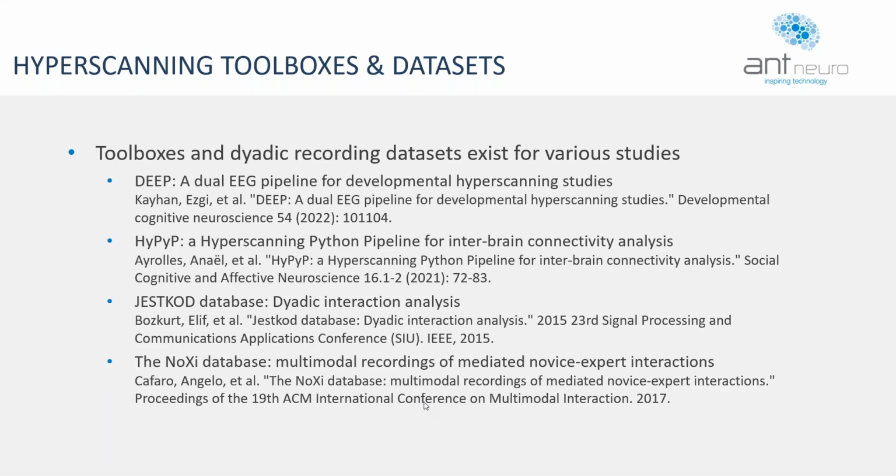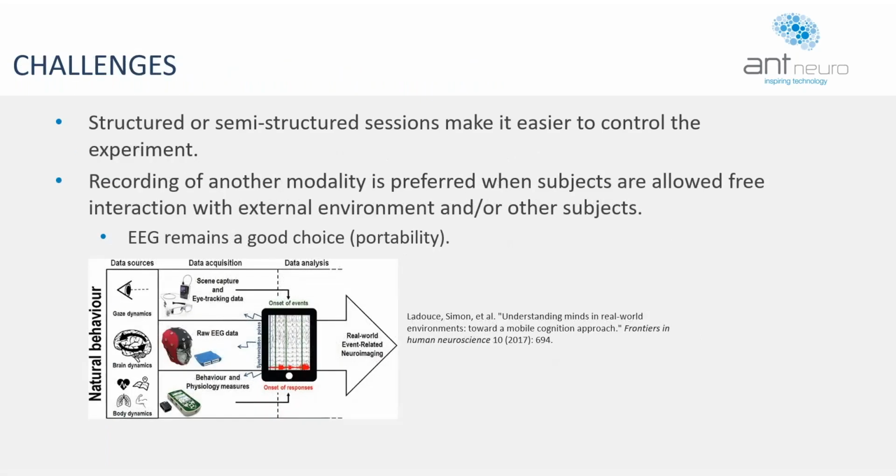This brings me to the slide on challenges. Like I said, as with any realm, we have challenges when it comes to hyperscanning studies too. The first is that when you have a structured or semi-structured session, it is easier to control the experiment.